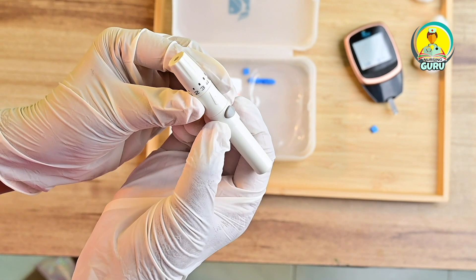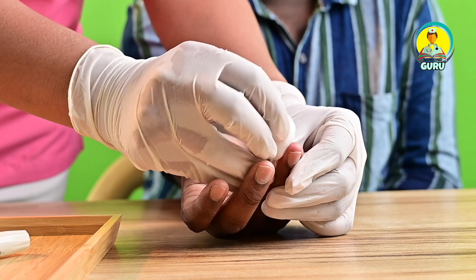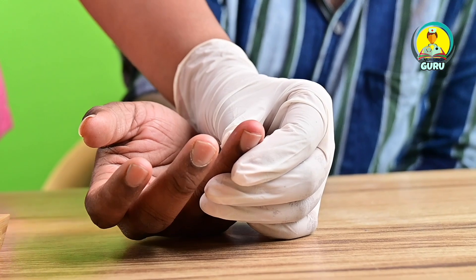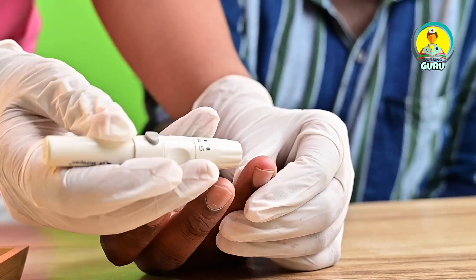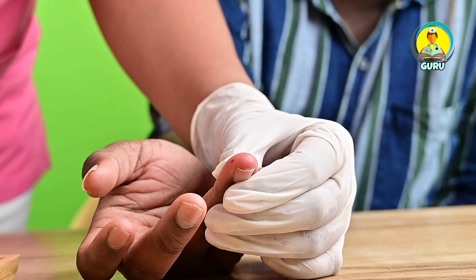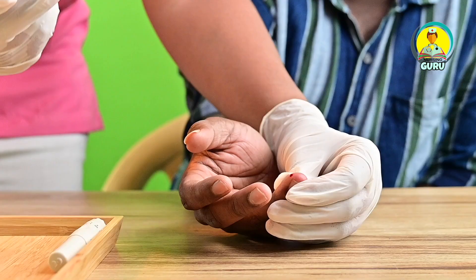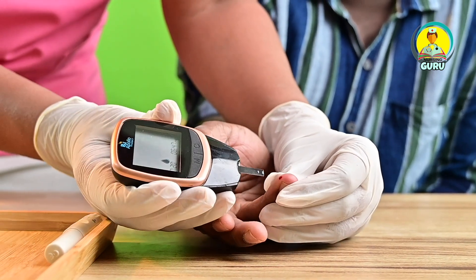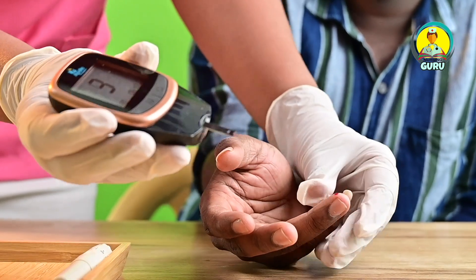Select the appropriate puncture site and massage the side of the finger with an alcohol swab. Hold the lancet perpendicular to the skin and prick the site. If needed, wipe away the first drop of blood, then lightly squeeze until a hanging drop of blood has formed. Gently touch the drop of blood to the test strip without smearing it.